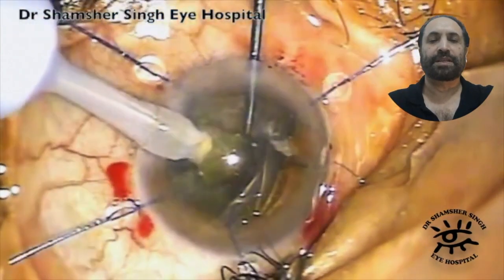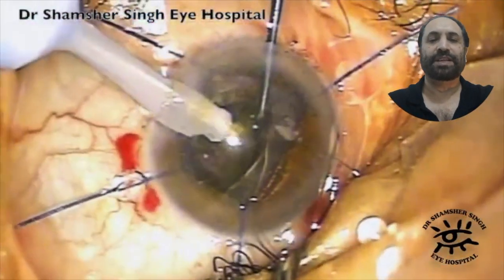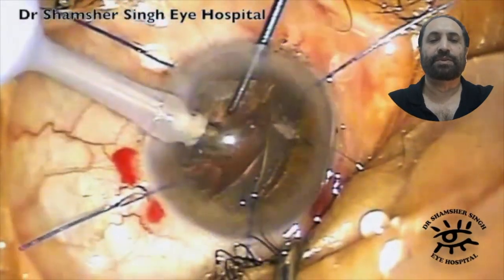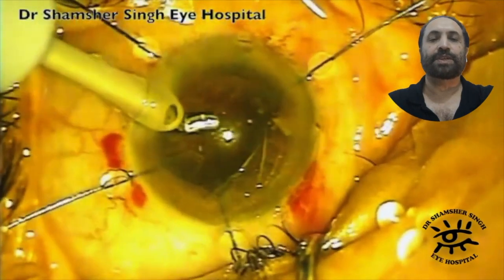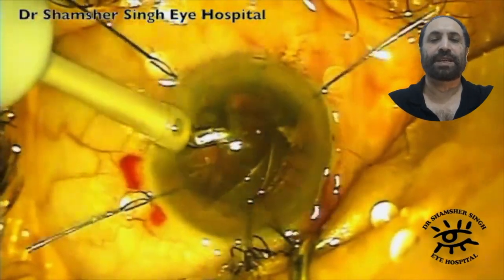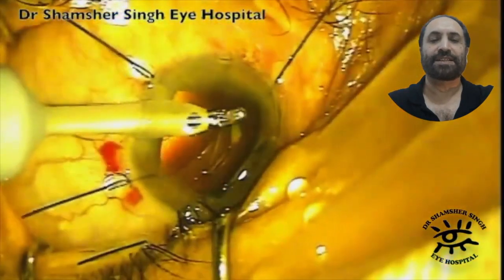In this case I'm using my old Millennium phaco machine which I really loved — it was a superb machine, but of course it's now out of service. I'm doing the irrigation aspiration here. In those days I used to change my filter to a yellow filter, hoping that this would be a bit kinder to the retina.